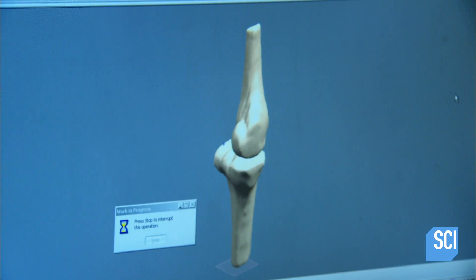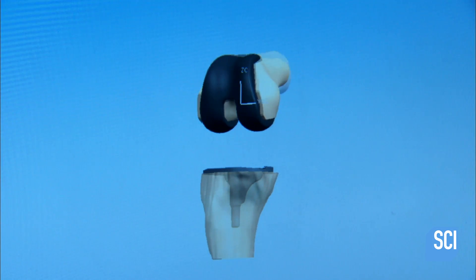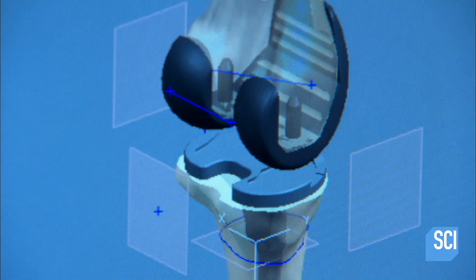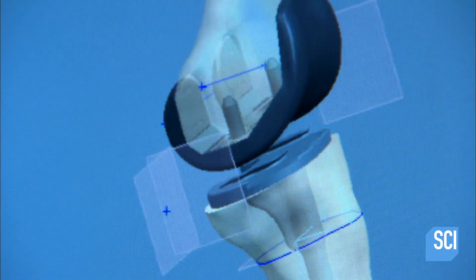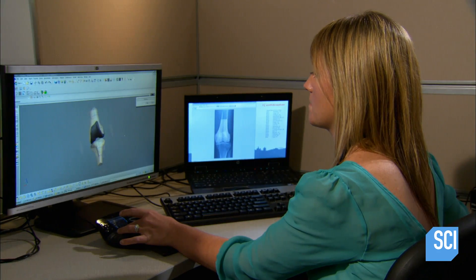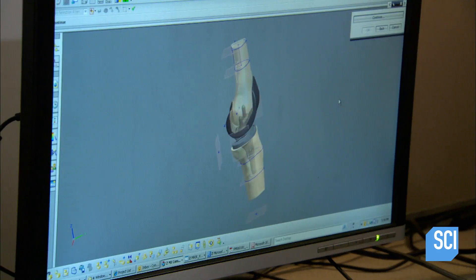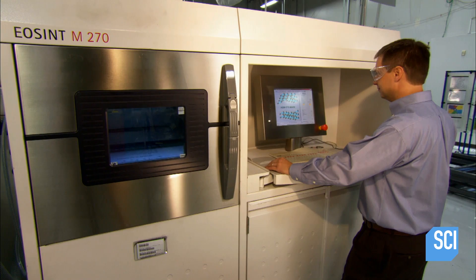Once each bone model is ready, another engineer applies a 3D model of the correct size implant. Then, following directions the surgeon has provided, performs virtual surgery on the bone model. This will properly align the implant to the patient's specific anatomy and fit it to the angle at which that particular knee moves. During the surgery simulation, the computer records every bone cut. The surgeon reviews and approves the surgical plan only once before manufacturing begins.